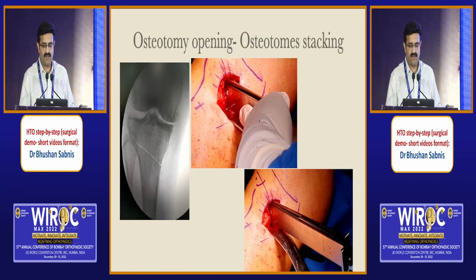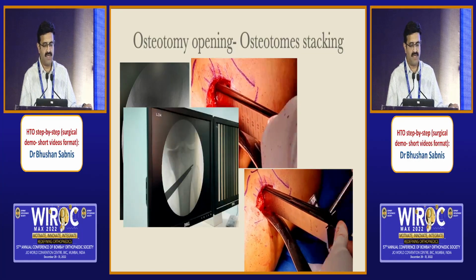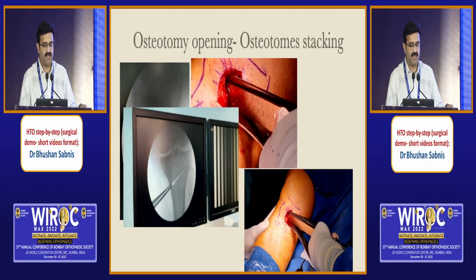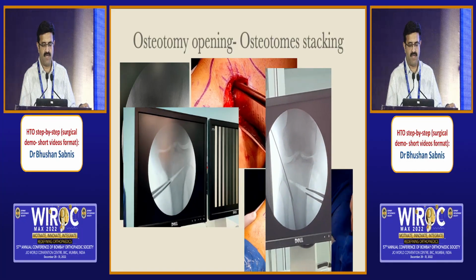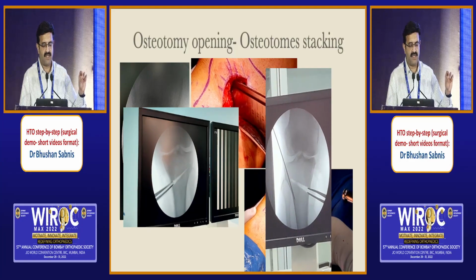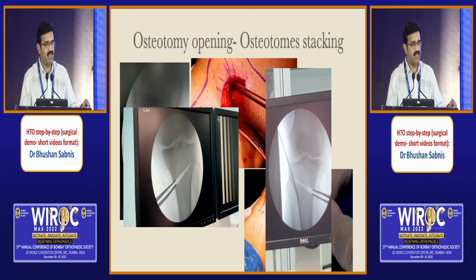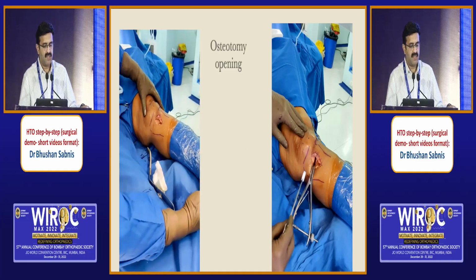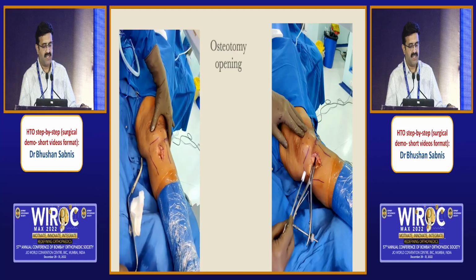Once you've done that, you need to stack in osteotomes, which will open the osteotomy in such a way that your hinge will remain intact, and you can play with your osteotomy to see if you are able to maintain the hinge. Sometimes you put a hinge pin such as this and make sure that your hinge is intact, and you're opening and closing the osteotomy under vision without worrying about hinge breaking or any untoward effect happening. If you've done a good job, you will see the osteotomy opening and closing nicely just by moving the foot like that.